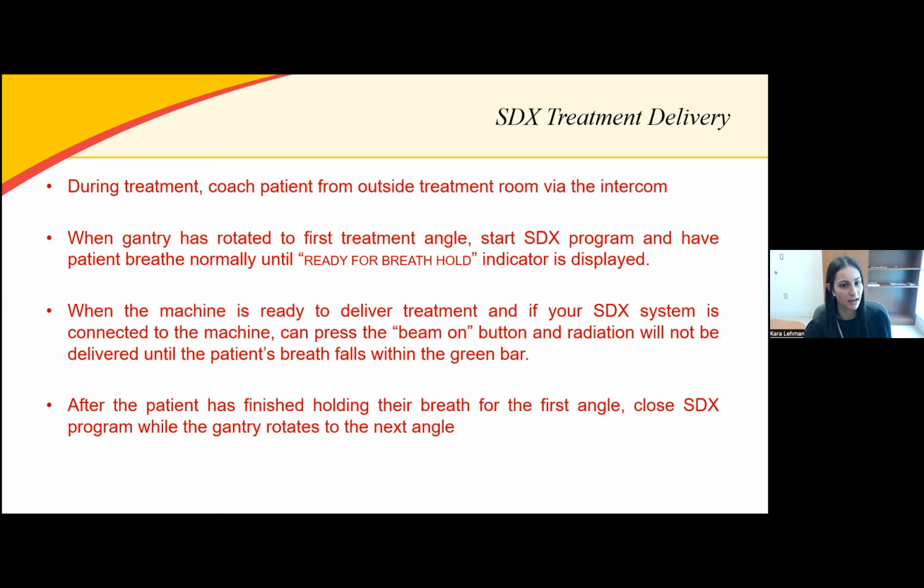But the only suggestion I have here is something that we do on our treatment computer: we can see how much of the beam is left to deliver in terms of a percentage. So you can tell a patient that, because they really don't know how long each beam will take. So for us, we'll normally say you're at 25%, you're at 50%, and that lets the patient know how many breaths they want.